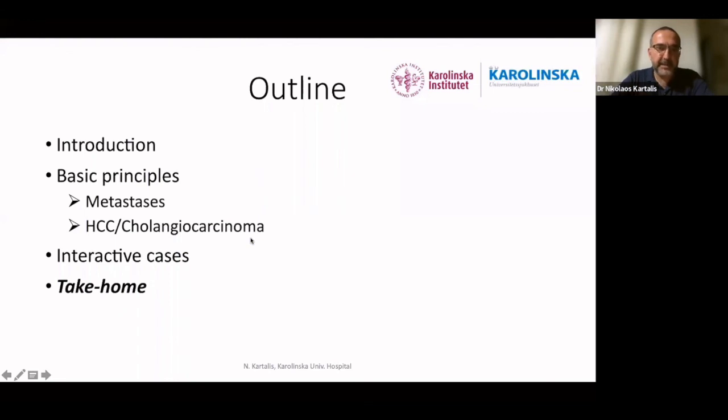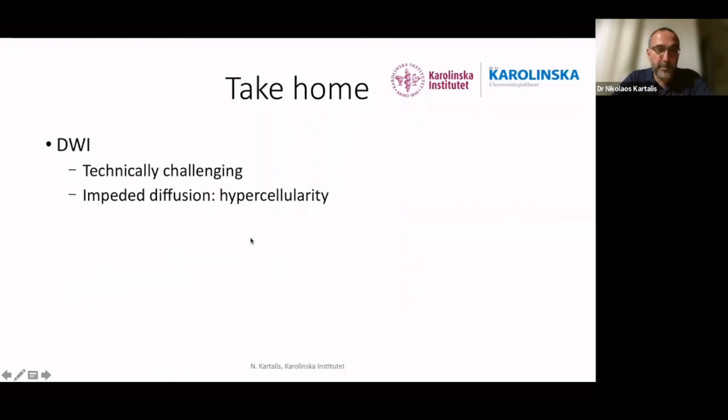We have been discussing a lot, and probably our audience is a bit tired. So for the take-home messages: diffusion-weighted imaging is technically challenging and diagnostically challenging. Sometimes benign lesions may show impeded diffusion, and malignant lesions may show free diffusion. And remember, impeded diffusion is a sign of hypercellularity and not necessarily of malignancy.